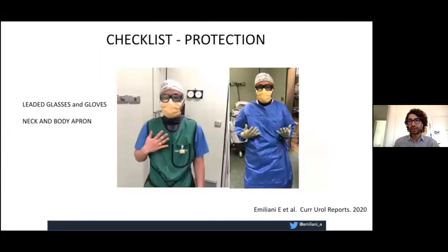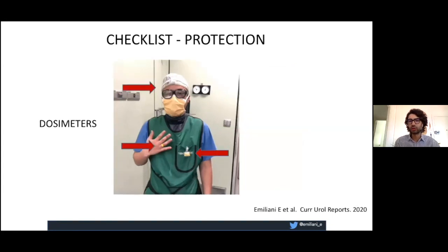Protect yourself and protect the people in the OR. Use leaded glasses, leaded gloves, and neck and body aprons, as you can see with my colleague here. I always use dosimeters — it's very important to check your activity. We use three dosimeters: one on our hand, one next to our glasses to measure fluoroscopy exposure to the eye, and one worn below the apron.